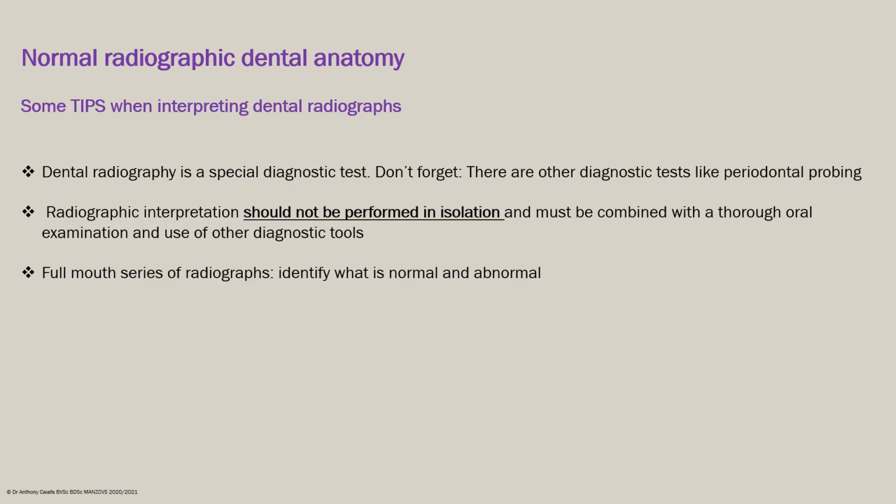These are some of my tips when interpreting dental radiographs. Dental radiography is a special diagnostic test. Don't forget there are other diagnostic tests that you need to perform at the same time, and this includes periodontal probing. So we should not perform radiographic interpretation in isolation, and we must combine this with a thorough oral examination and the use of these other diagnostic tools.